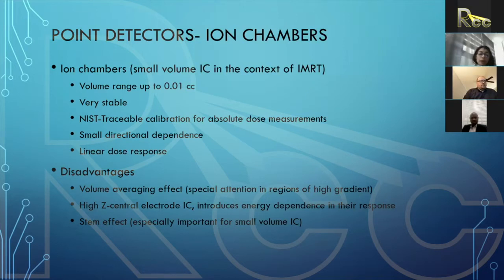And also you might have a stem effect with ion chambers. Especially, this is very critical for the small volume type of chamber. And this is related to how stable your chamber is, depending on whether a portion of the cables are in the beam when you are taking your measurements.